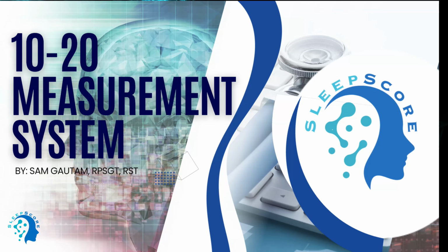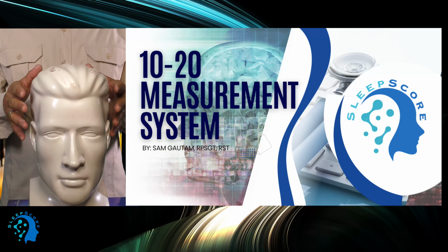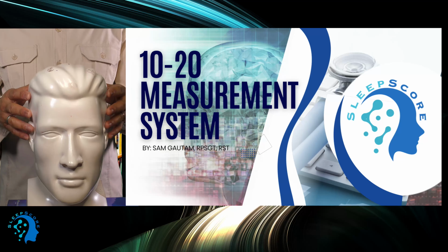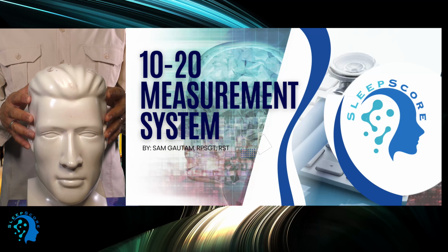Good morning. Today I'm going to teach you about the 10-20 measurement system and how to do measurement for polysomnography. That's a head measurement. Here we go. Now this is the head, or we have to consider the head of the patient. For polysomnography, we need to do the hookup. The 10-20 measurement system is called that because everything you measure is on the basis of 10 and 20.